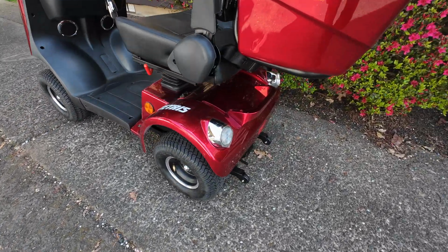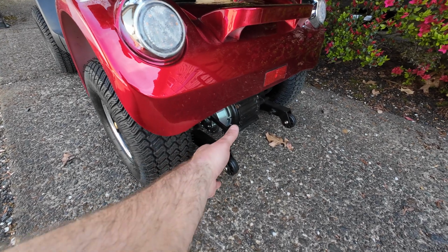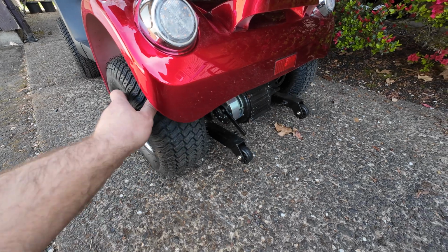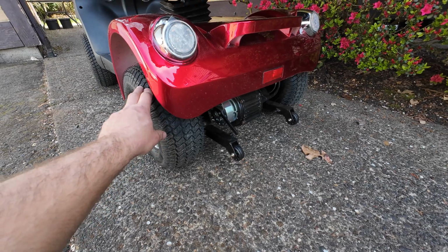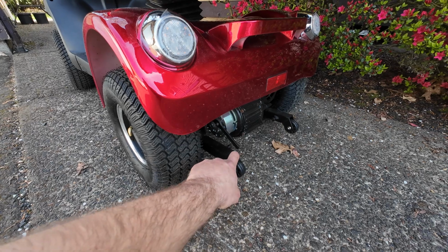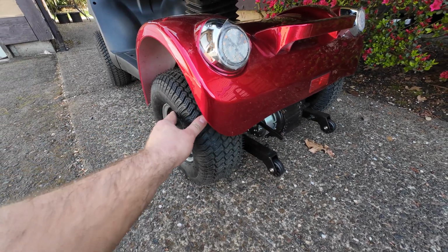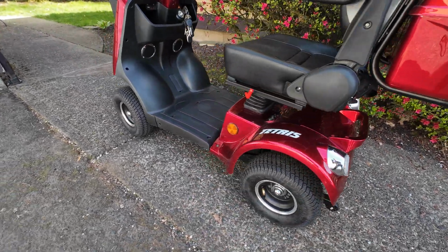Now for some of you that never knew about this lever right here, if you push it down, it will let you roll your scooter inside of the garage, for example, or even in an emergency situation, if you have some problems with the scooter and it needs to be towed, rolled, or pushed, then you push this lever down. But if you're removing the wheels, you have to leave it in the up position, just like you would be driving on a daily basis, so the motor will be locking the axle.